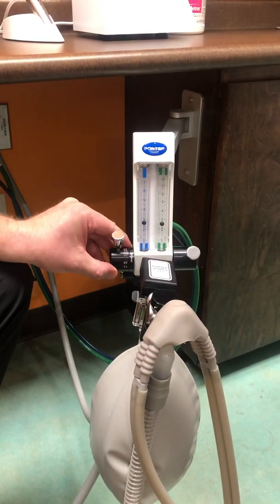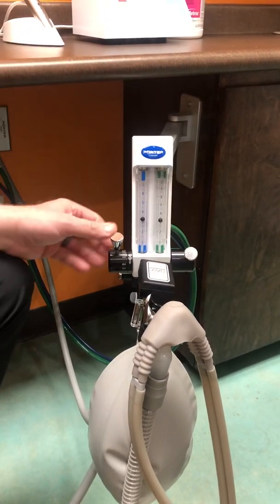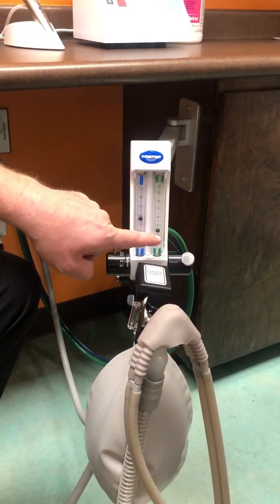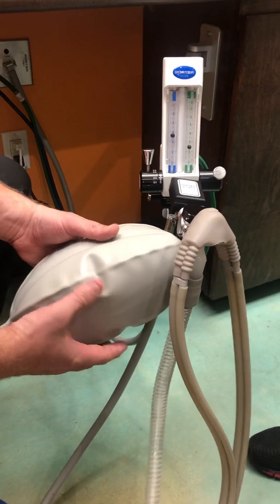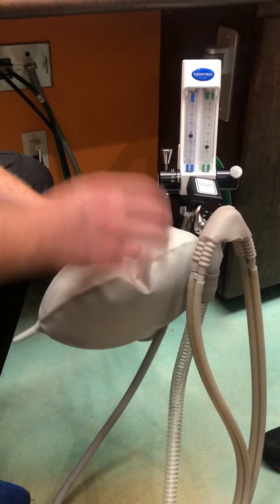If you move that down to 50, it does the same thing — you see how the two balls are basically identical to each other. We run our patients on 60, and usually having it at about 60 with the oxygen between 2 and 3 is just about the right amount of gas to have your balloon properly inflated. You'll notice it's not super tight — it's kind of loose and flexible.